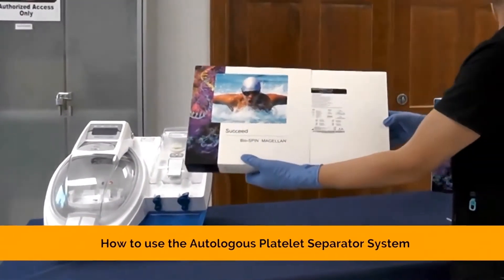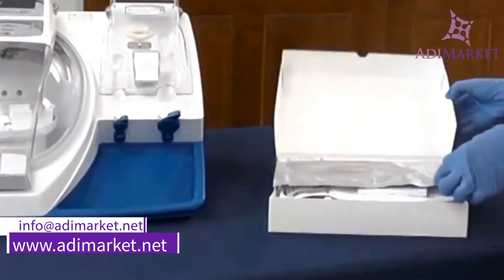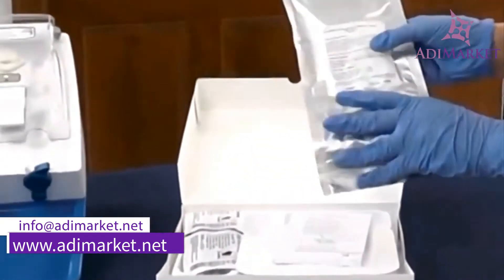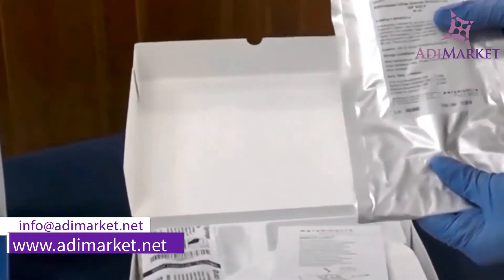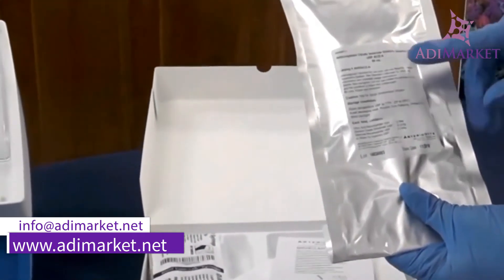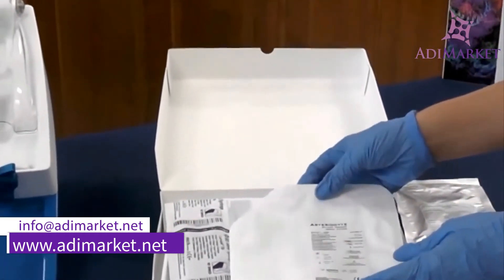To start, we'll go ahead and take off the sleeve. Within your box you will find your ACDA, and I'll draw this into my 60 milliliter syringe prior to my blood draw. For a full 60 milliliters of blood, you will need 8 milliliters of ACDA to start.